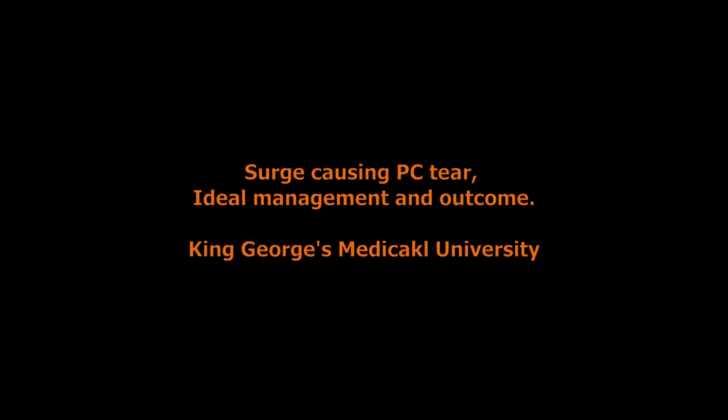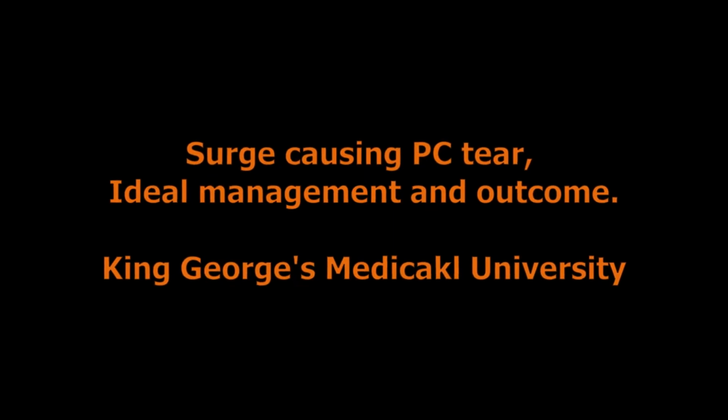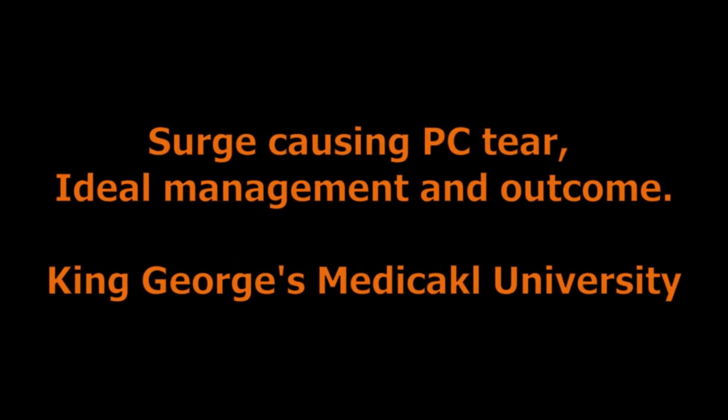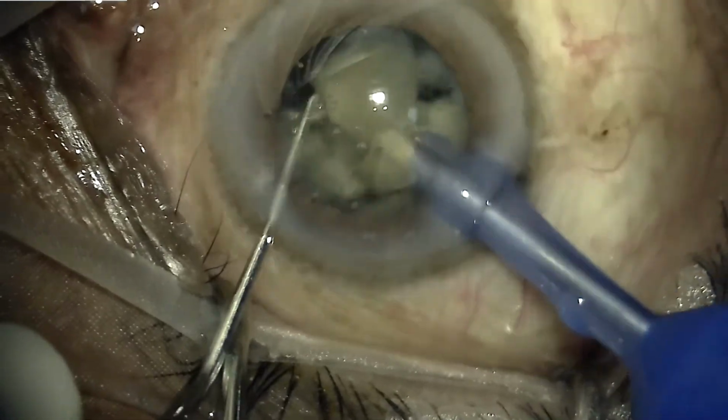In this video, we'll see how some inappropriate settings in a phaco machine can cause surge, which can cause some complications, and how these are being managed.